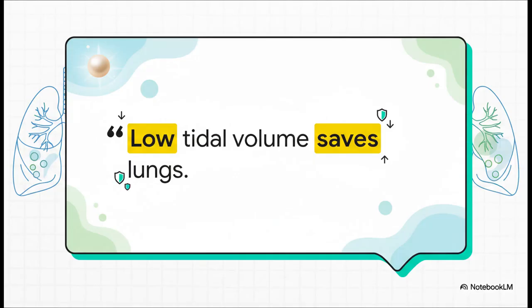This brings us to a huge point, a real pearl of wisdom you'll hear in any ICU. When you're in doubt, especially with very sick lungs, like in the condition called ARDS, the strategy is always this: low tidal volume saves lungs. It is a fundamental rule of lung protection.